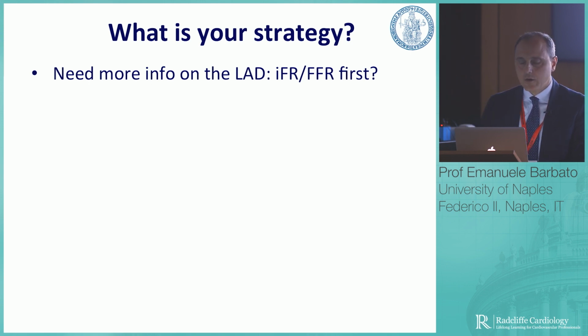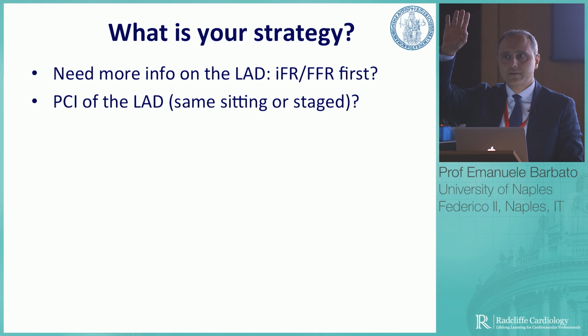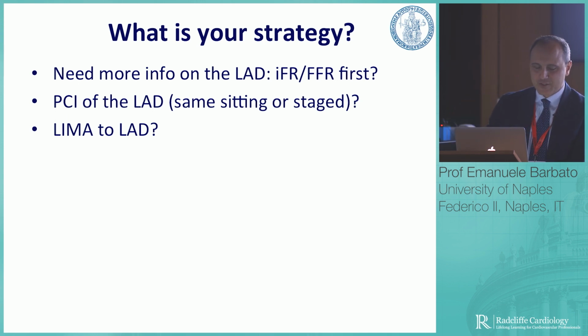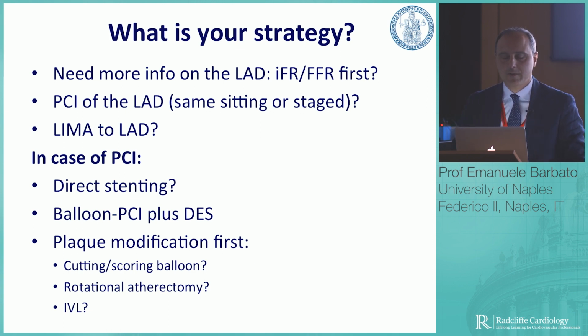Okay. Who believes this stenosis is really tight enough and deserves angioplasty? Raise hands. Not so many. Let me check if there are surgeons in the room. Who wants to offer a LIMA to the LAD to this patient? No surgeons. So from those of you wanting to perform a PCI, I'm curious to hear who would do direct stenting in this LAD. Raise hand. Direct stenting. No one. Who would do balloon PCI plus drug-eluting stent, or at least give it a try with a balloon first? Yeah, let's put it this way, the majority.